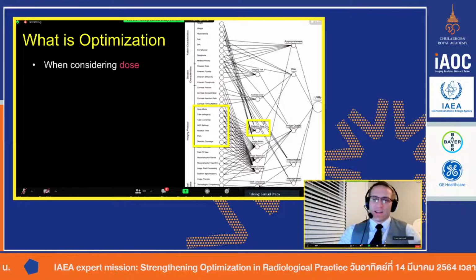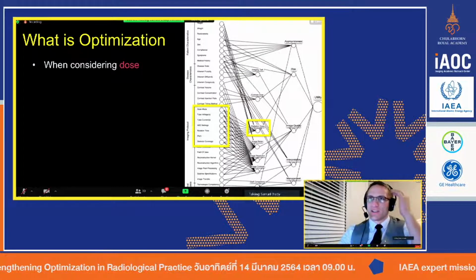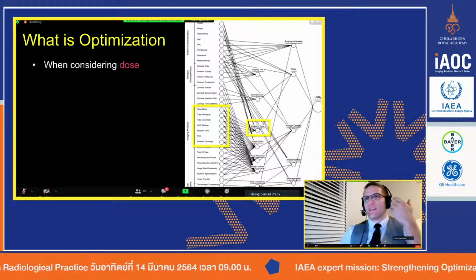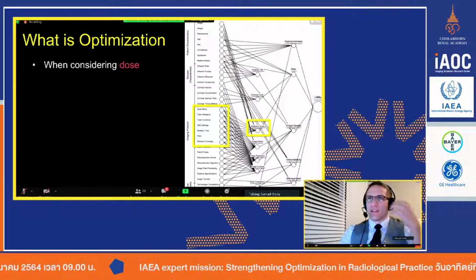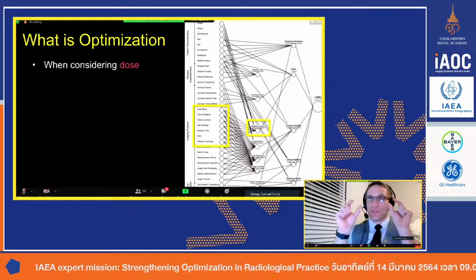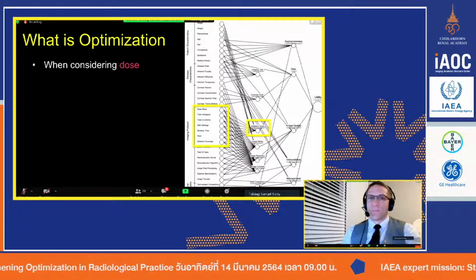Yes, and now that I think about it, up to this point, everything is the same for the brain. I focused a lot on the brain because we do a lot more brain than face. But when you're doing soft tissue face, you're looking at sinuses, and then inner ear. Those are probably the next. For inner ears, obviously, you need good spatial resolution, so you need a good field of view so that you can really see the tiny detail of the bone of the inner ear.